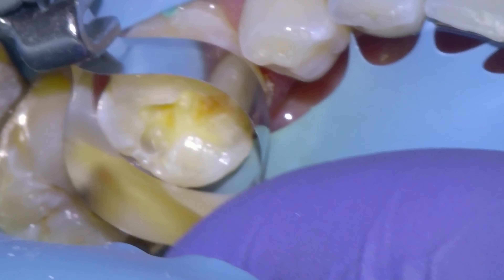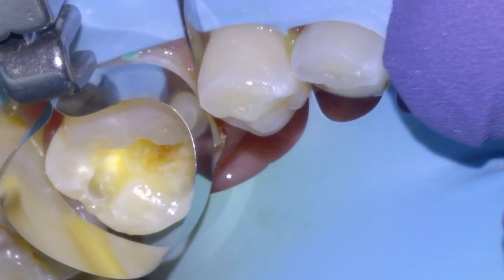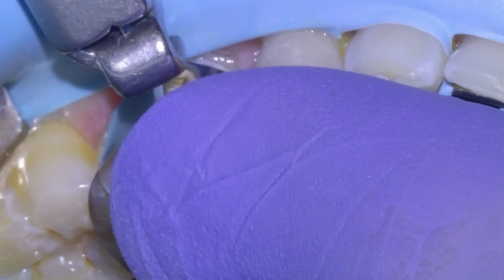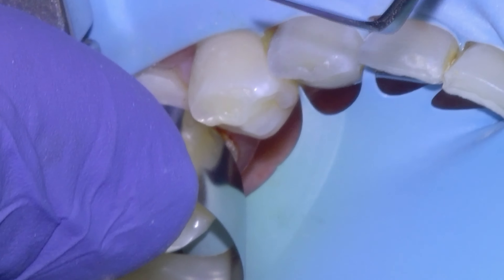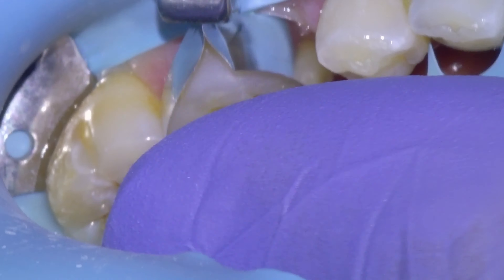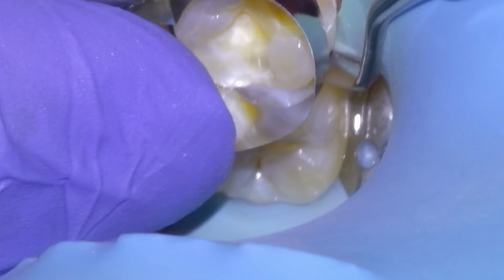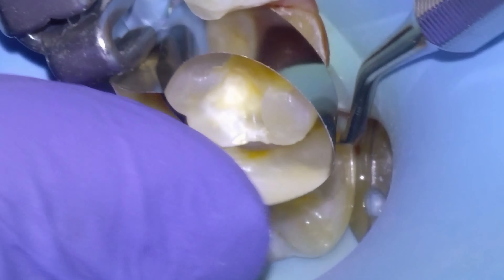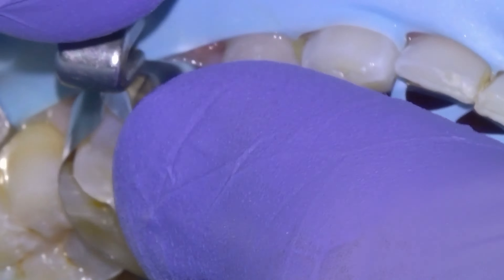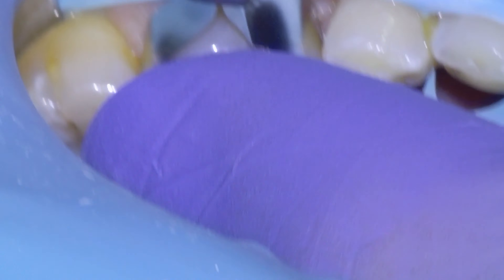We're ready to put the band around the tooth, which is just something that holds the filling material in place. It can be a little tricky to get these on when the contacts are still intact, so sometimes I'll use an instrument to wedge the teeth apart so the band can slide down into place. Got the front side down, and we're going to do the same thing for the backside — placing the instrument between the teeth, wedging them apart, pushing the band in, and we've got the band on there.